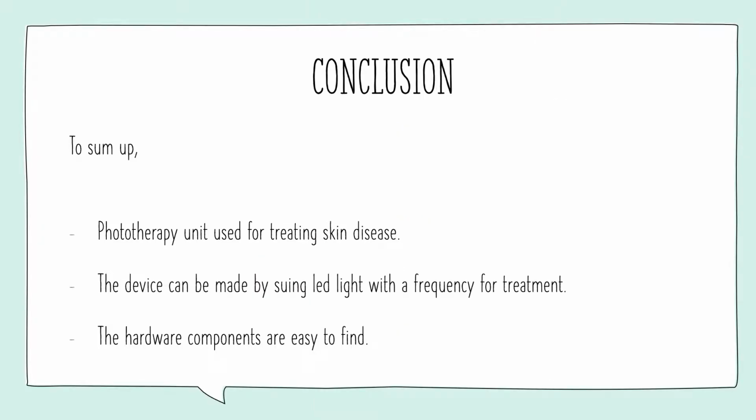So in the conclusion, to sum up what we have done, the phototherapy device has been used for 60 years for treating hyperbilirubinemia and jaundiced babies. The device uses LED light to break down the bilirubin in the body, which makes the yellow color in the patient or in the babies.